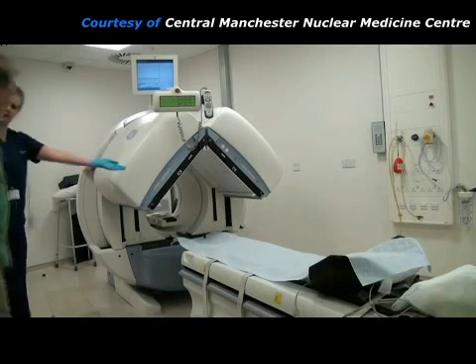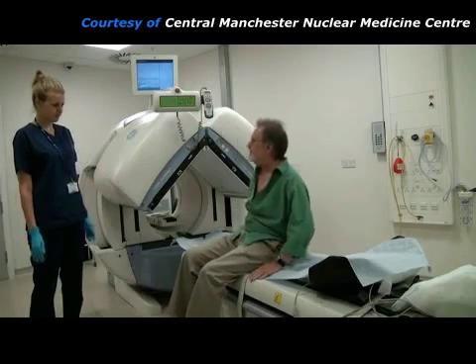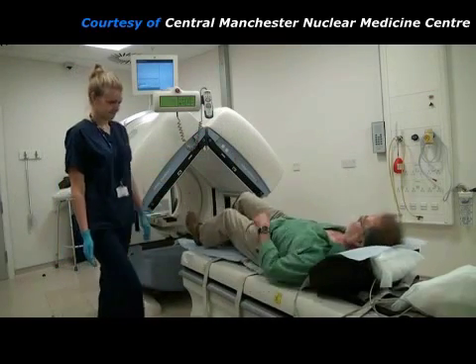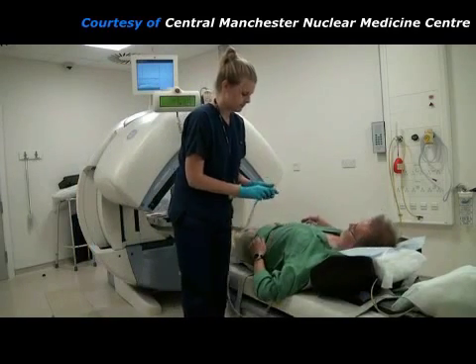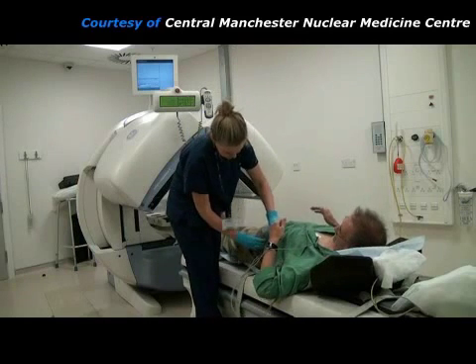This is the gamma camera that will take the pictures of the radiopharmaceutical in the patient's heart. The patient lies on the imaging couch and the practitioner attaches 3 ECG leads to the electrodes that are already stuck to the patient's chest. This will allow the gamma camera to take pictures at different times during each heartbeat.